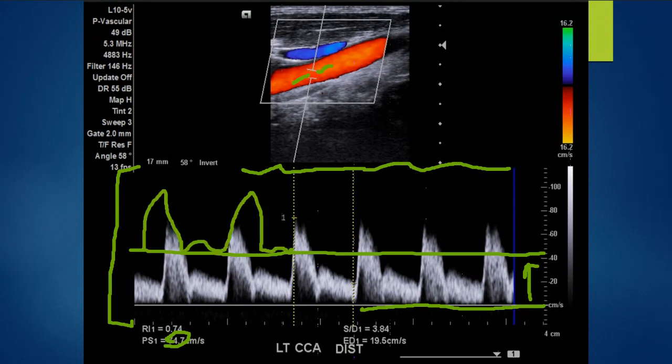Now, it didn't make our waveform appear any larger. It didn't occupy any more space of the spectral window. We're not getting any more of a crisp appearance of our waveform. So yeah, it kind of gets rid of the extra space at the top of our spectral window, but it kind of just adds it down to the bottom underneath the baseline for that spectral window.